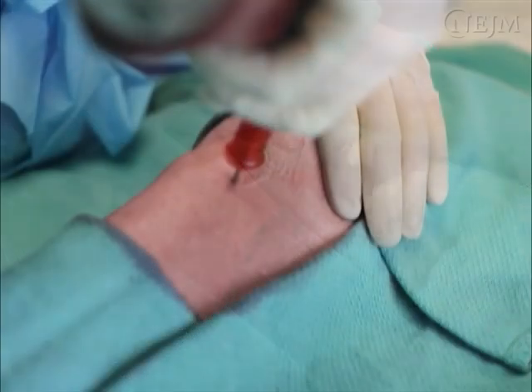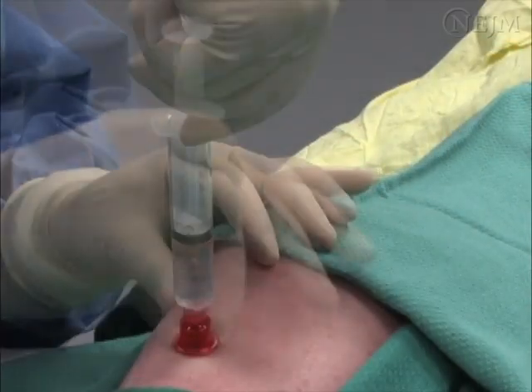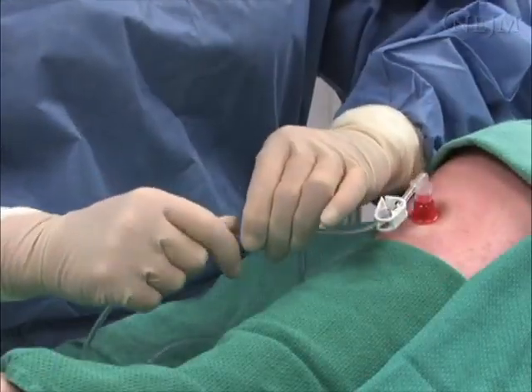The intraosseous route provides fast and reliable vascular access in emergency medical situations. The use of the appropriate technique will ensure that the procedure is performed as safely and effectively as possible.